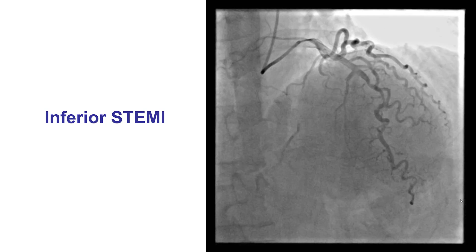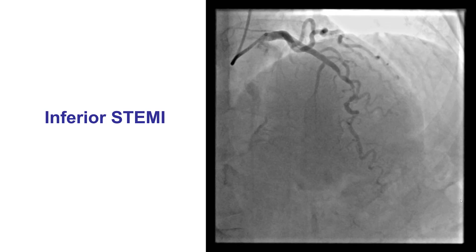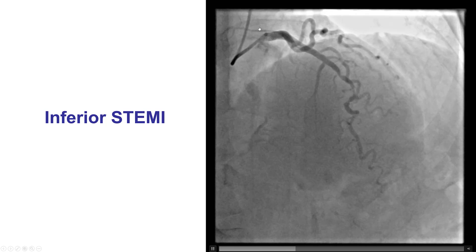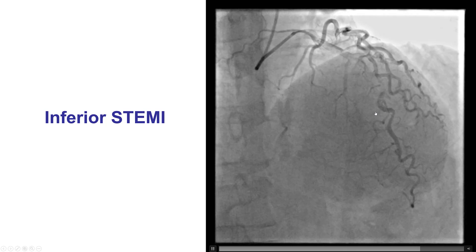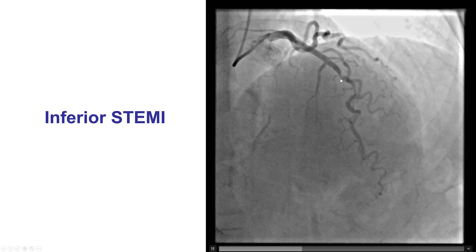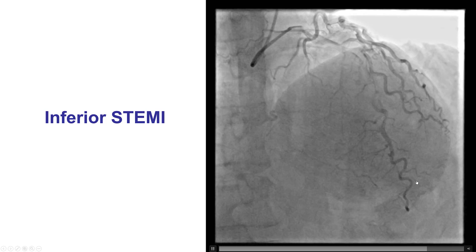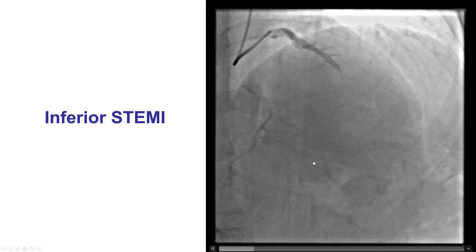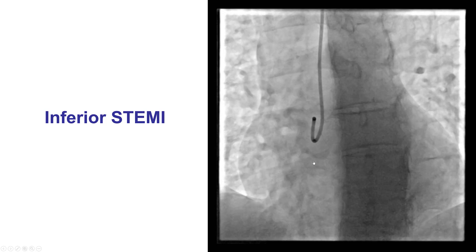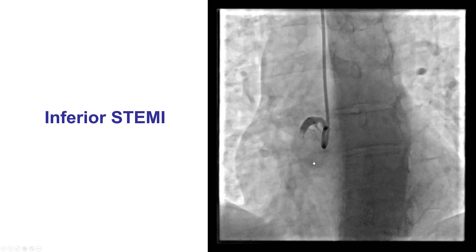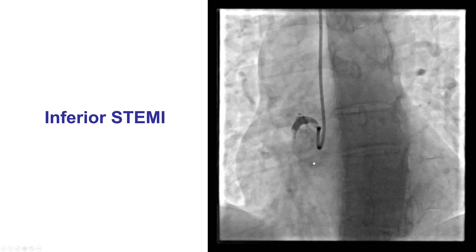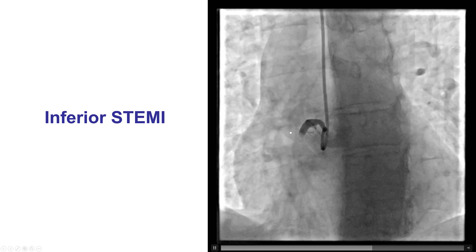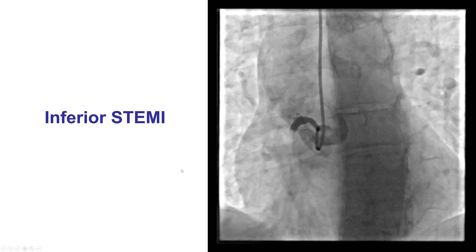The patient presented with an ST segment elevation inferior MI. Right radial access was obtained and diagnostic angiography demonstrated significant disease in the mid-LAD, however with preserved antegrade flow. There was some retrograde filling of the PDA as well as the posterolateral vessel. Injection of the right coronary artery confirmed an occlusion of the mid-right coronary with a large intraluminal filling defect suggestive of thrombus.